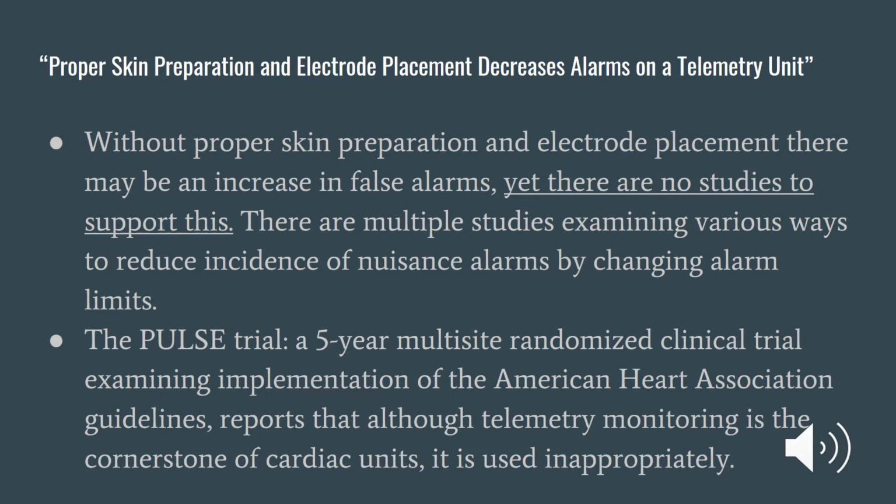Furthermore, this study states that without proper skin preparation and electrode placement, there is an increase in false alarms. However, there are not studies to support this. There's very little research over this topic, but there are multiple studies examining various ways to reduce incidence of nuisance alarms by changing the alarm limits, which we can simply do on the telemetry monitors.